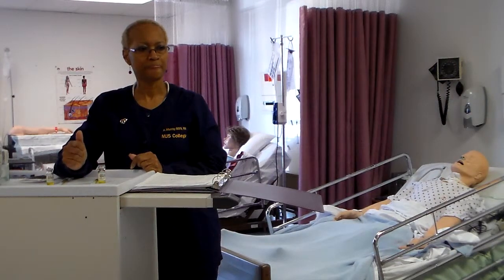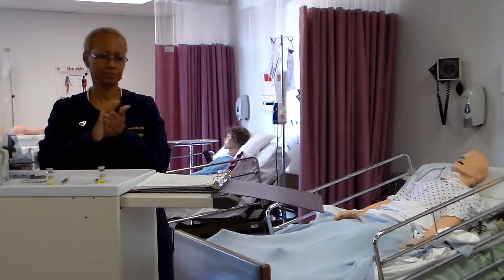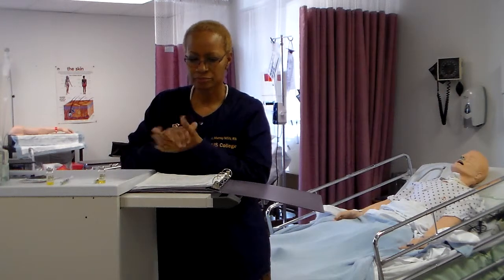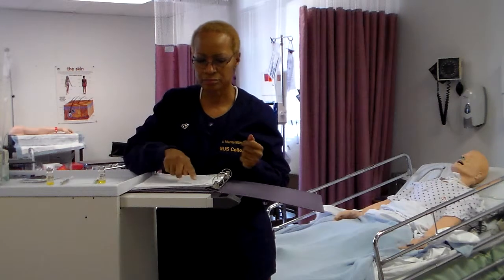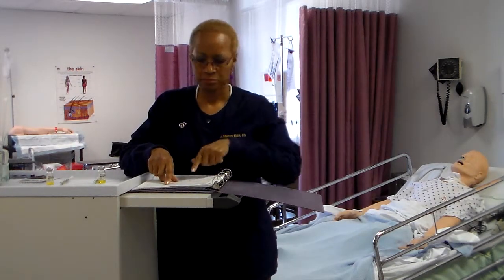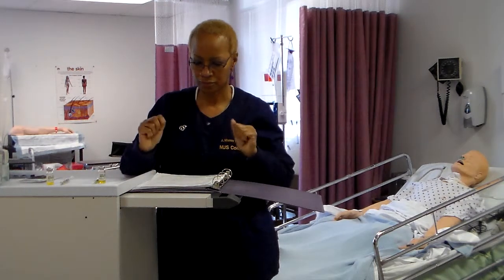Okay. Administering injections. Check accuracy and completeness of each medication administration record, MAR, or computer printout with prescriber's original medication order. Check client's name and medication name, dosage, route, and time for administration. Recopy or reprint any portion of MAR that is difficult to read.